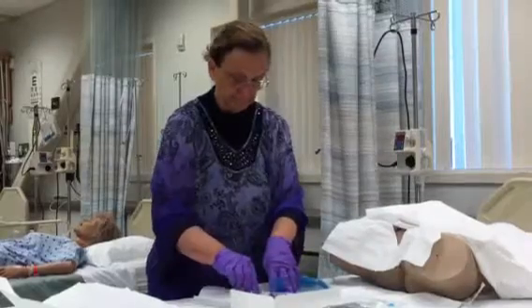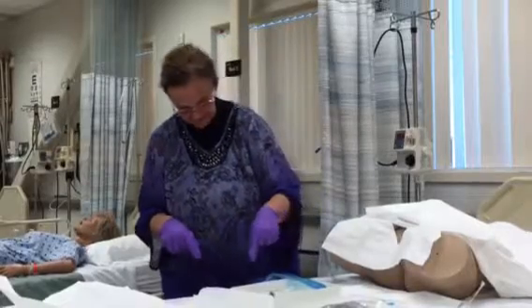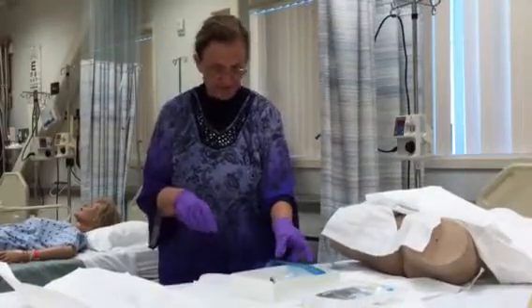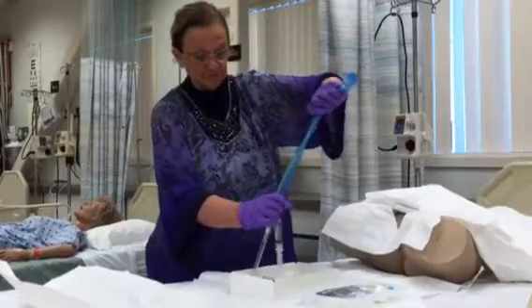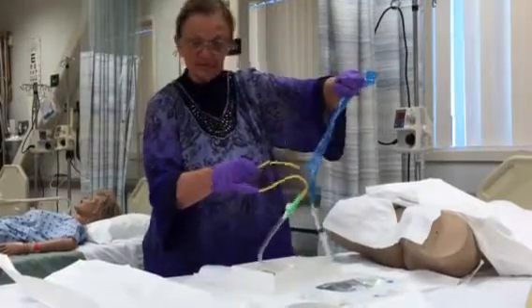You're going to leave the balloon inflated. I mean, the balloon deflated. Okay. And now my catheter outside came here on my non-sterile field. Do you see what happened? But I'm still going to be able to salvage this, because what I'm going to do now is take the paper off, and keep my catheter sterile. So I was able to salvage that.